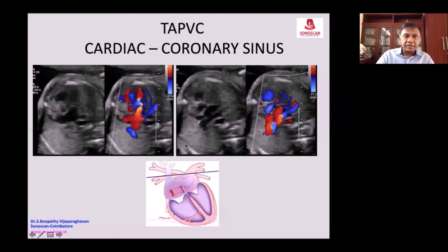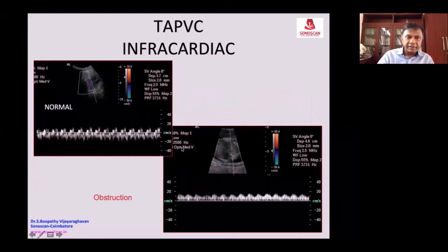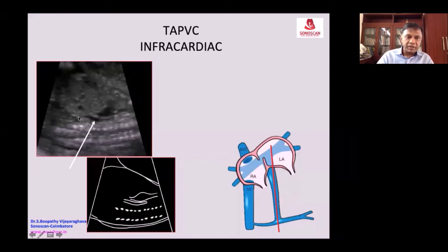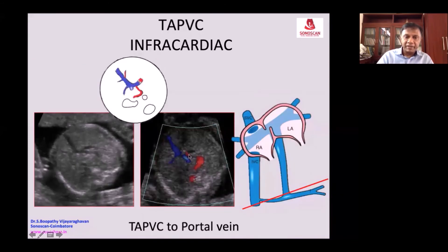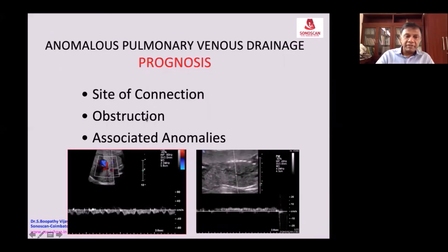Here again you see the pulmonary veins joining together and immediately opening into the coronary sinus. Through the four-chamber view you see the pulmonary veins joining together, and then the vertical vein going down into the abdomen. It goes from there into the abdomen, passing and joining the portal vein. This is the additional vein coming and joining the portal vein — the difficulty of surgery depends on whether it is obstructed or not.